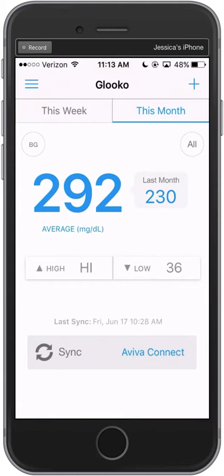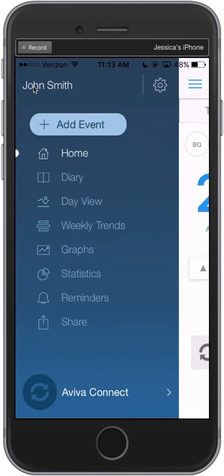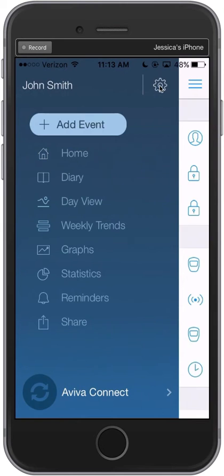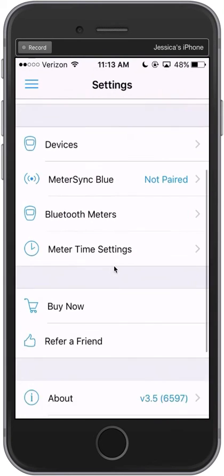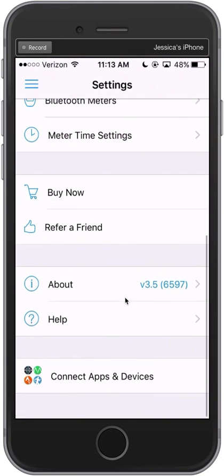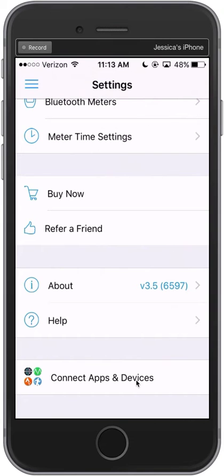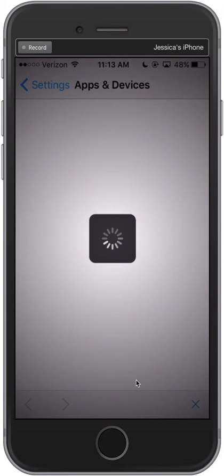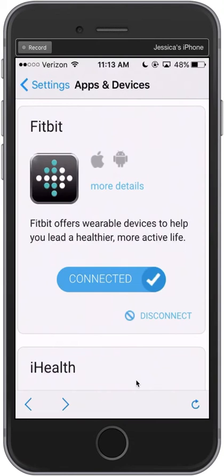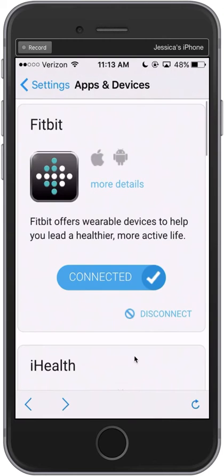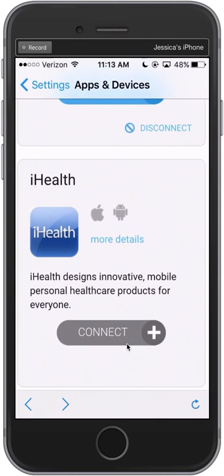From your Gluco app, go to the side menu and click on Settings. Scroll to the bottom and select Connect Apps and Devices. Here you can see the list of supported fitness or activity apps. Tap on the one that you would like to connect to Gluco. The on-screen instructions will walk you through the rest.